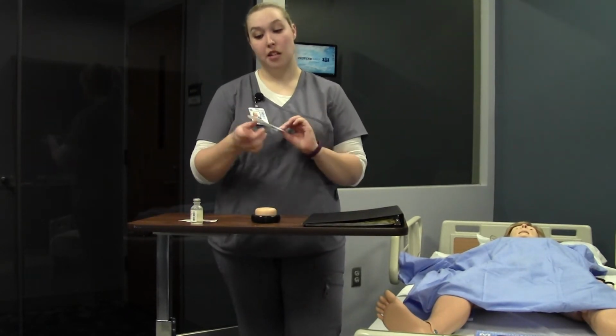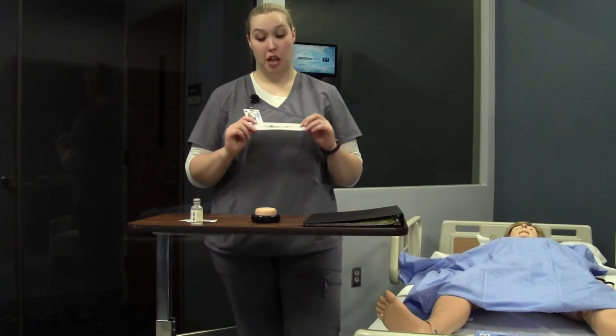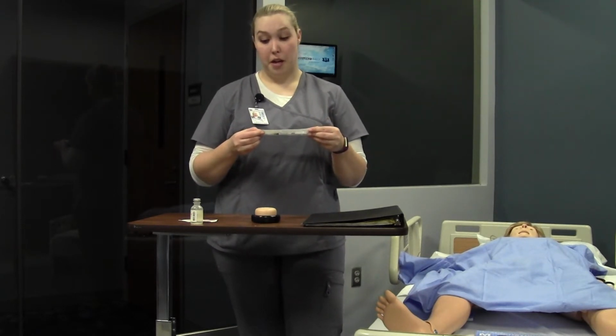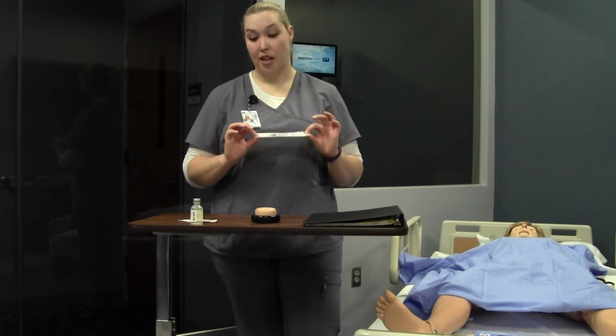The syringe that I need is a 1 milliliter disposable syringe. Some packages will say directly on the package it is a tuberculin or tuberculosis syringe, but it is a 1 milliliter Luer-lock tip with a 27 gauge 1/2 inch needle. So that is the correct size.